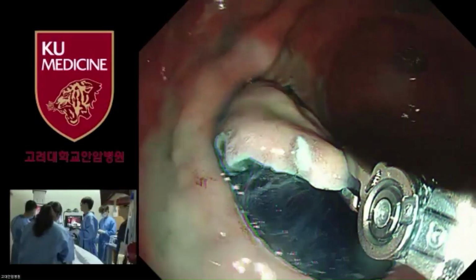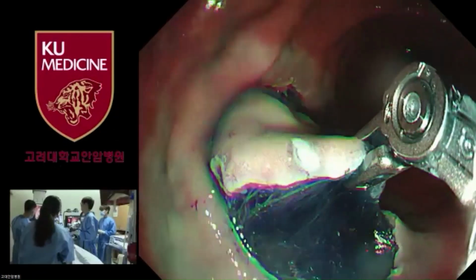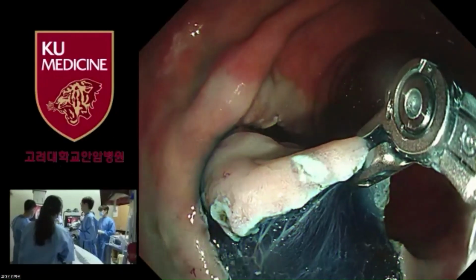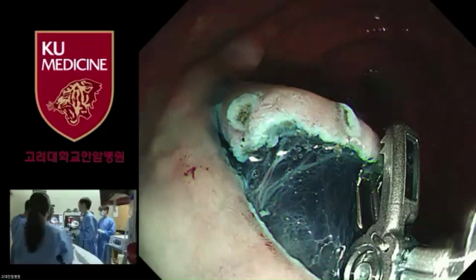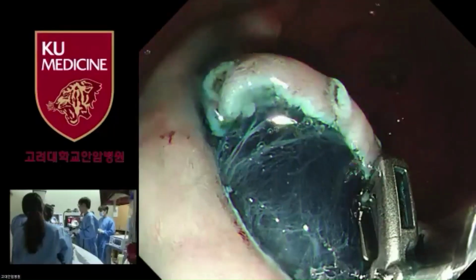Yes. Agree. Kinam, do you feel that you need a randomized trial to use the robot, or is it so compelling? Is it so evident that it helped that you don't need any trial and you just can use it? Yes, so actually, Professor Keum, do you have any data comparing the robotic devices using ESD with other conventional ESD procedures?